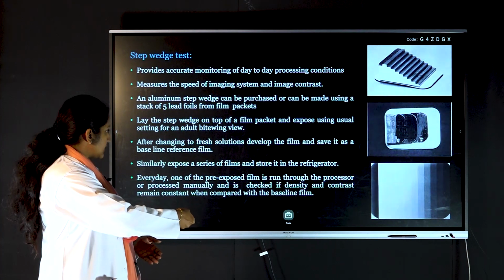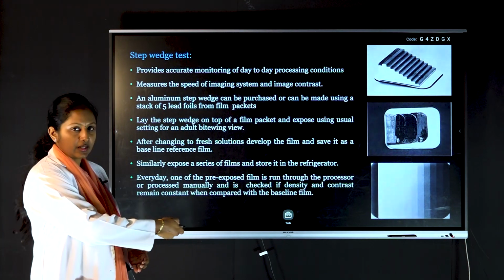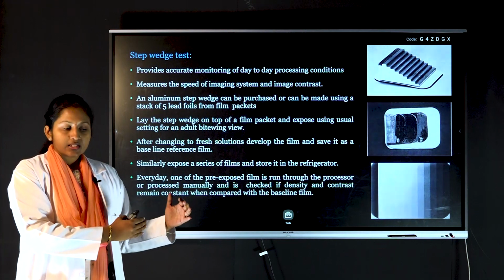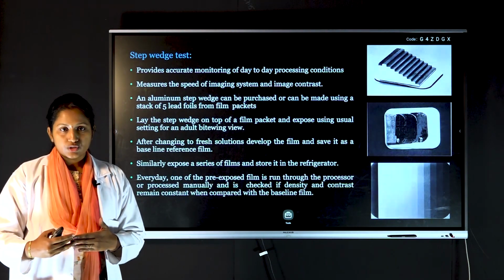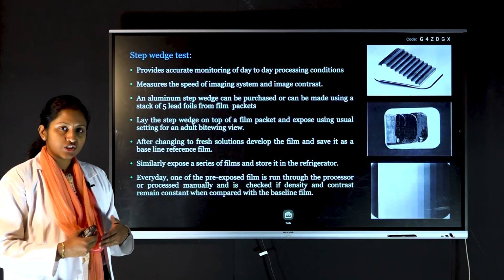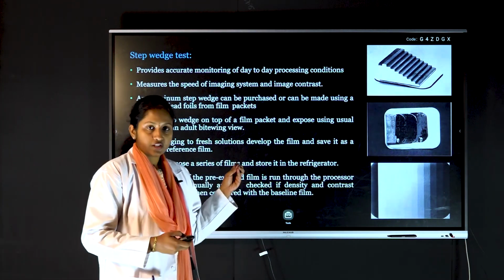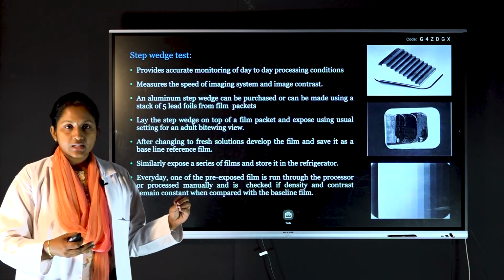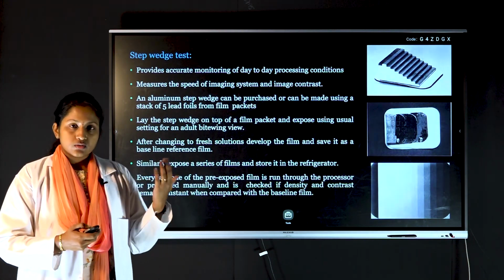As seen in this last picture, different grayscales will be seen on the film after processing. This is again taken as a reference film. Likewise, after changing to fresh processing solutions, or after replenishing the solutions every day, the reference films taken on the first day can be stored in a refrigerator for further use. Every day at the start of the day they can be processed and kept as a reference film for use for the whole day.